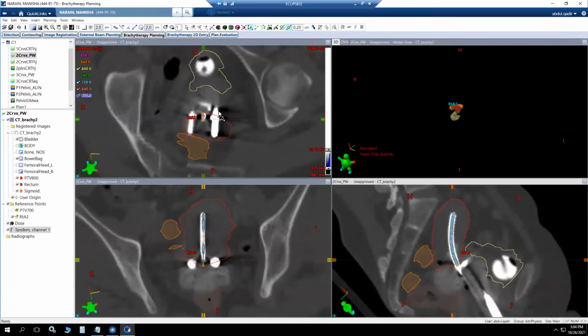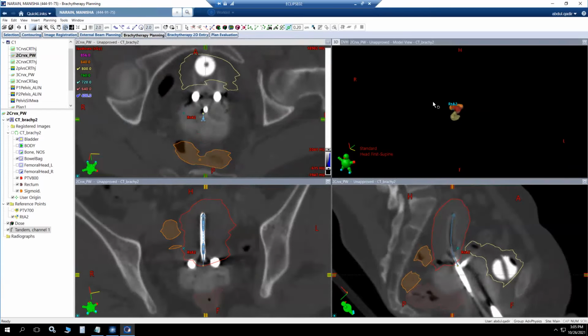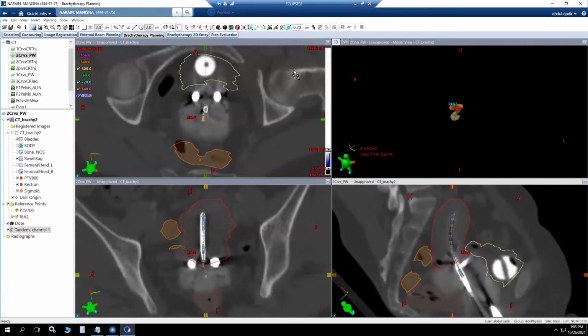Now if you want to move further, you can move the planes a little more. Let's go down and you see now it is visible. So you can continue your contouring. And you should mark beyond the os at least, because your channel length should be larger than your dwell source positions. I can correct this as well. Otherwise you will get errors while doing the calculation. So it is advised that you mark your channel length higher than the dwell source positions. So we're done with this.